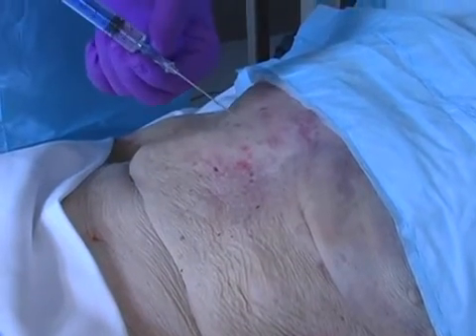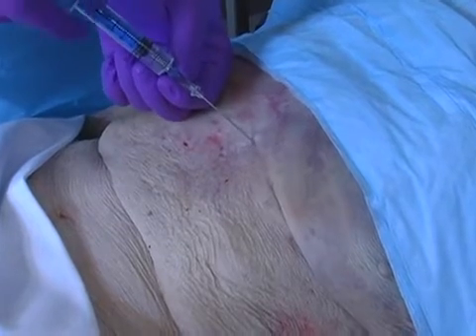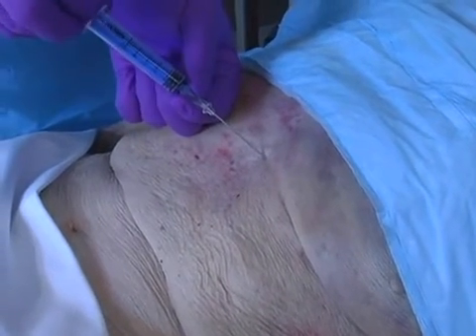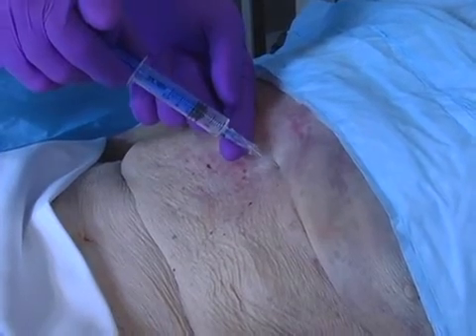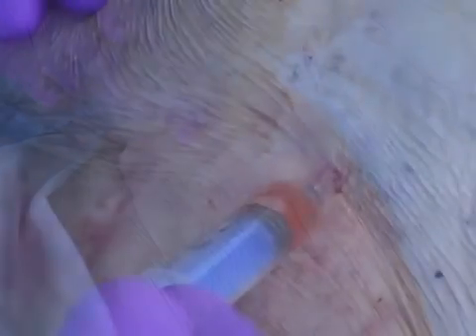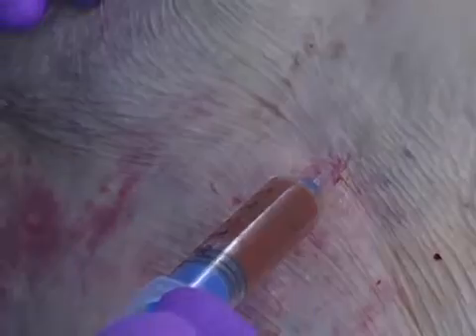If you do not have CT surgery on site, you may want to insert a triple lumen catheter into the pericardium using the Seldinger technique after you get return of spontaneous circulation to facilitate the removal of more fluid and to reduce the risk of damage to the heart with the needle. This is where it is easier if you've used the central line kit for the procedure to start with.